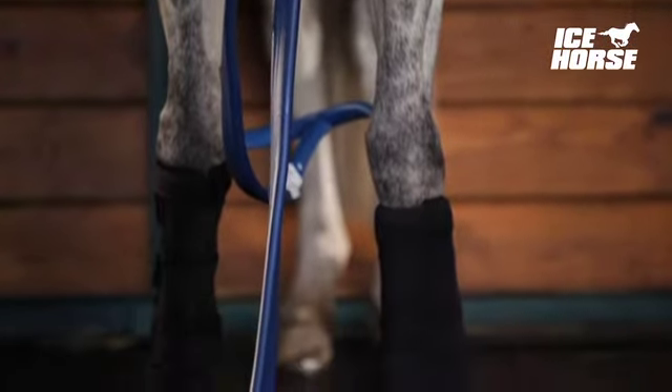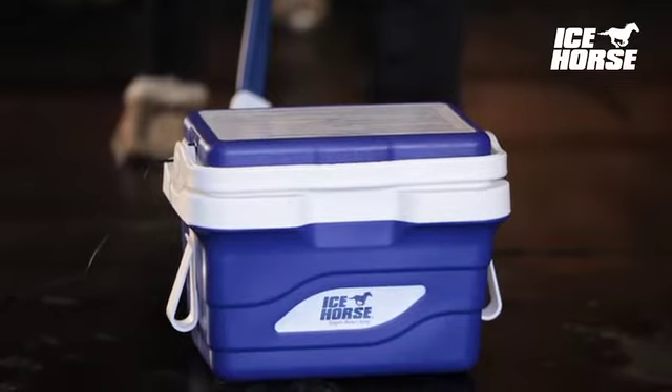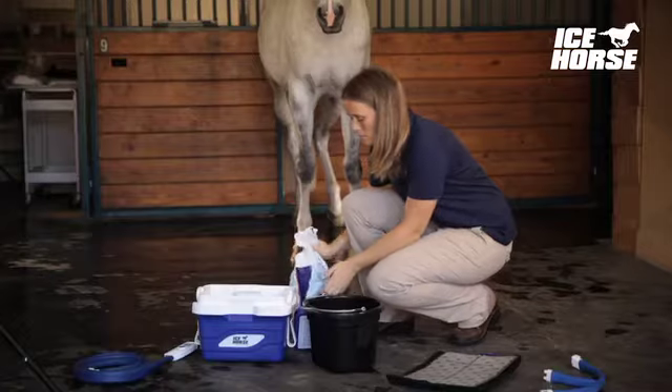Today's Icehorse course teaches you how to use the Icehorse continuous compression water system — the economical system that works to keep your horse's legs in top shape, or speed recovery after an injury.